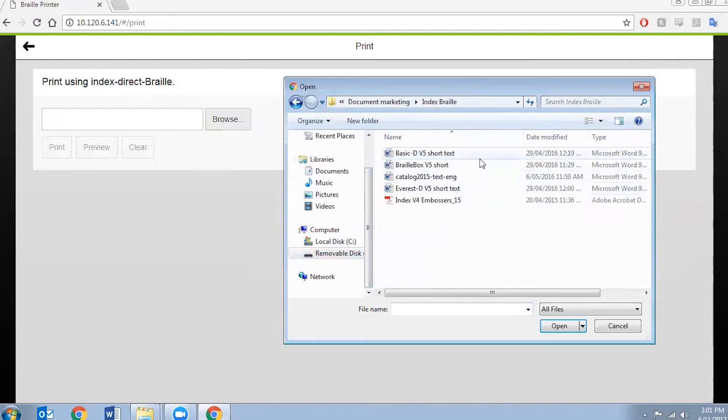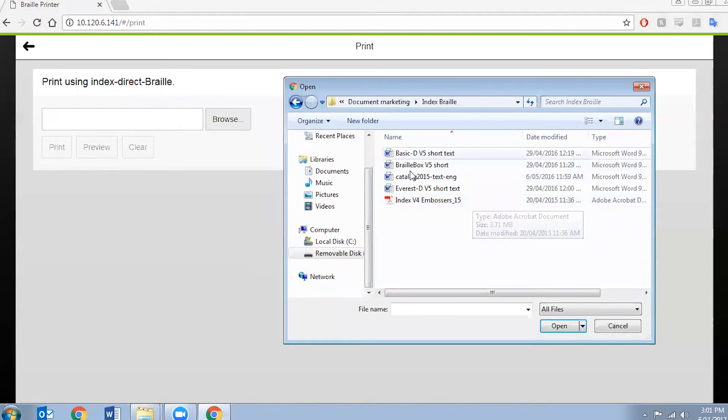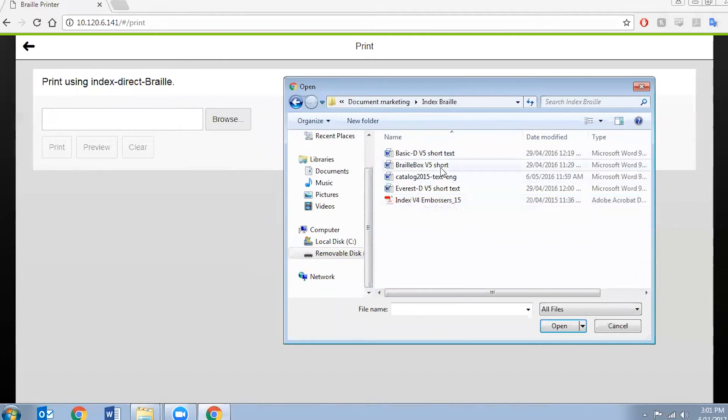So a couple of different formats that you can print is doc, docx, PDF, TXT file. So I'm going to choose just a basic docx file. Open it.